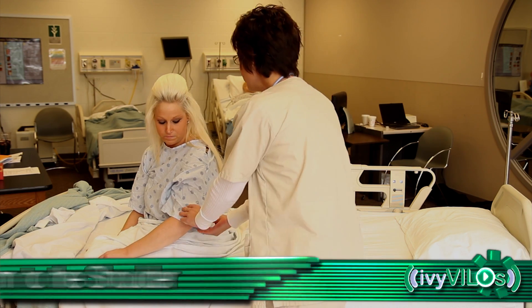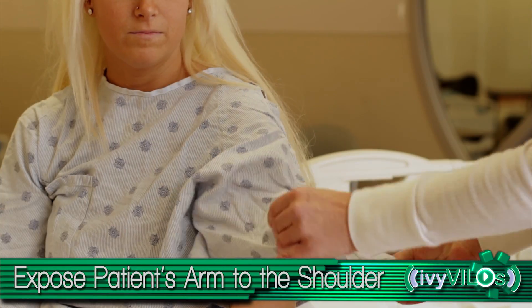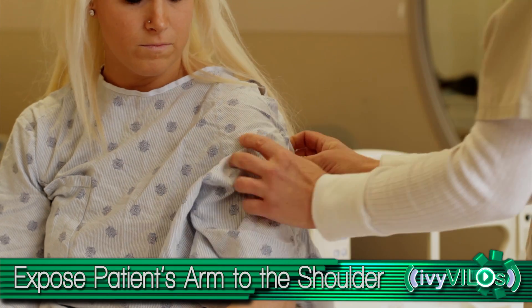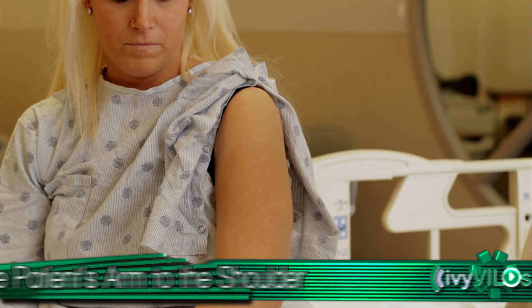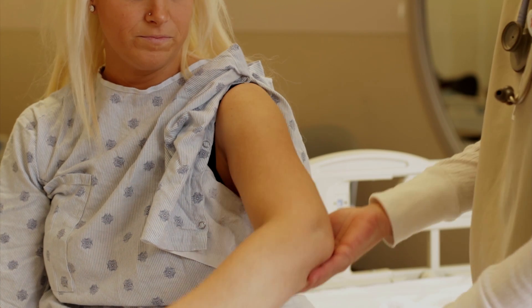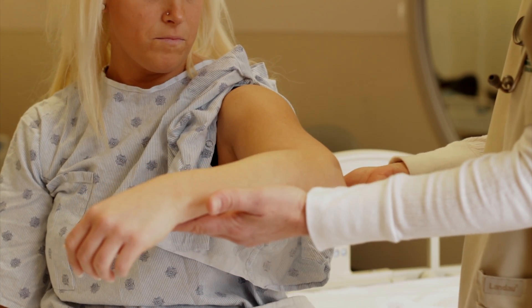Approach the patient and expose the arm to the shoulder. Have the patient flex their elbow and support the lower arm to relax the deltoid.